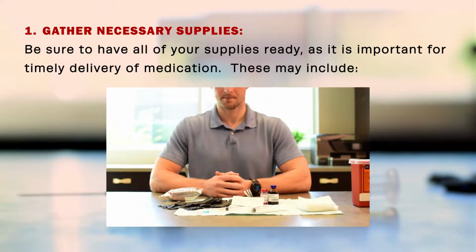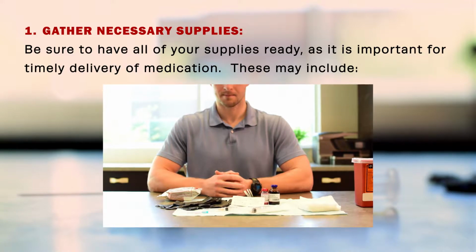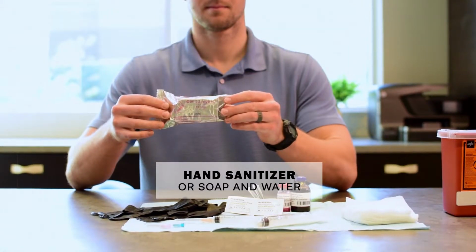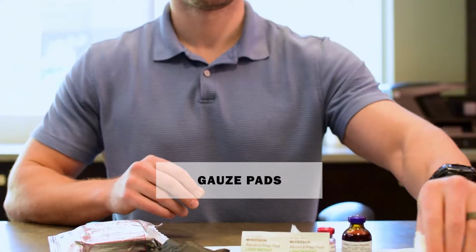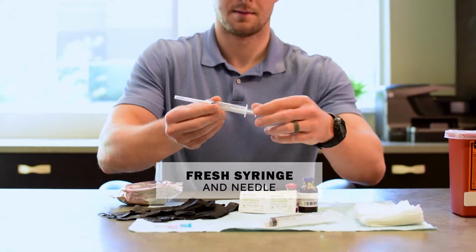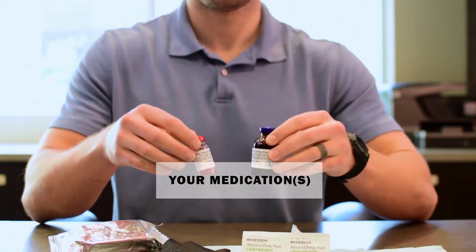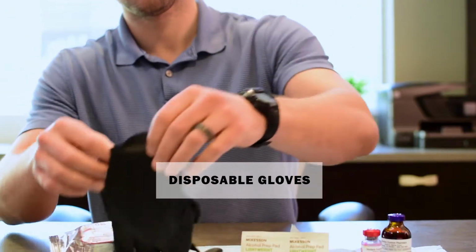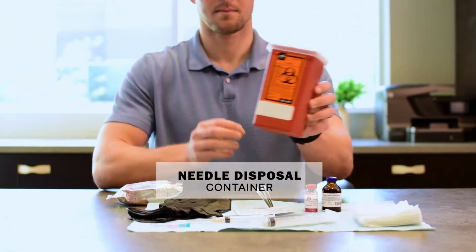Before beginning, it is important to make sure that you have gathered all necessary supplies. These will include hand sanitizer or soap and water, alcohol swabs, 2x2 gauze pads, a new needle and syringe sized accordingly, your medications, disposable gloves, and a needle disposal container.